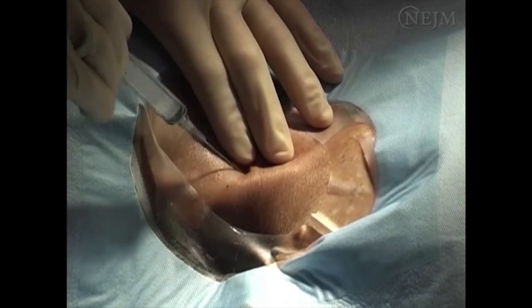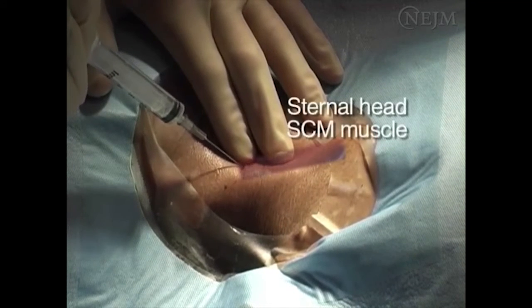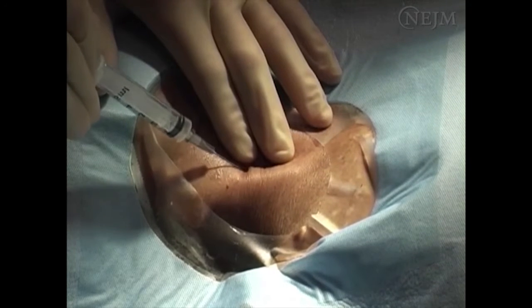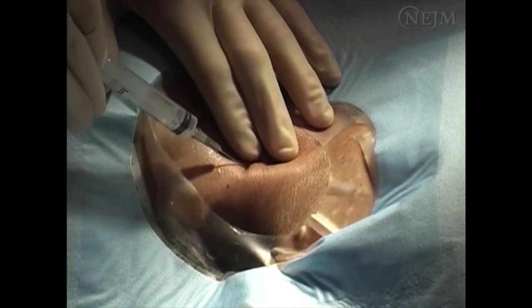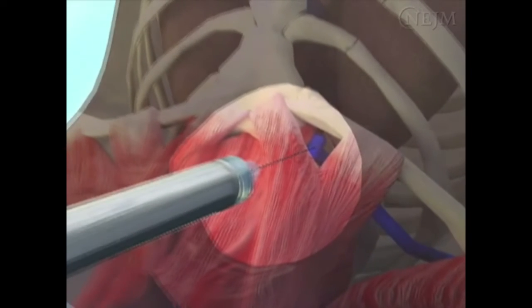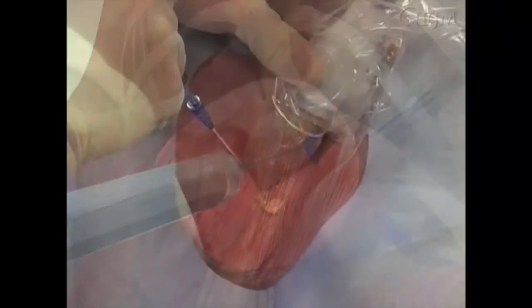Puncture the skin at the apex of the triangle at the medial border of the sternal head of the sternocleidomastoid muscle, entering just lateral to the carotid pulse. Advance the needle while applying gentle suction to the syringe. Continue to aim toward the ipsilateral nipple at a 45-degree angle to the skin, avoiding penetration into the deep tissues of the neck. Typically, the vein is accessed at a depth of less than 1/2 inch, or 1.3 centimeters.